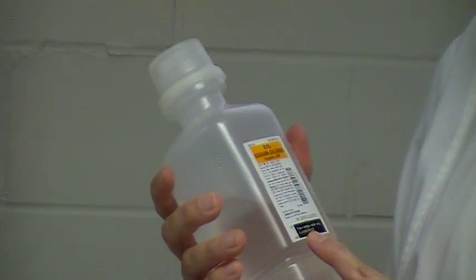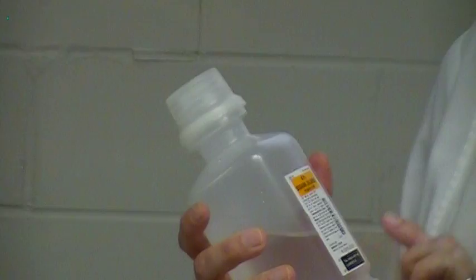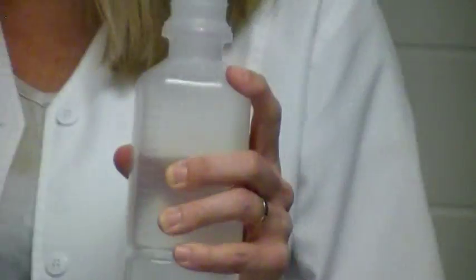You'll still want to make sure that the solution has not expired by looking at the actual date on the bottle. The first thing that you're going to do is lip your solution. We've talked about lipping already in class. So make sure that you pour your solution into your refuse container.